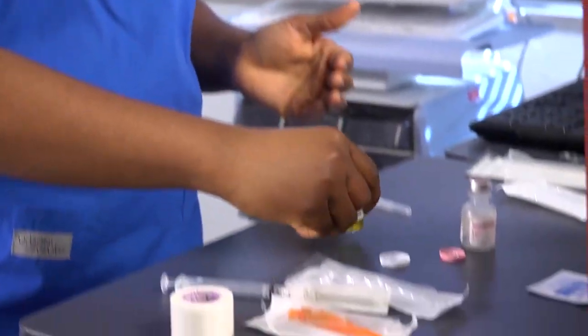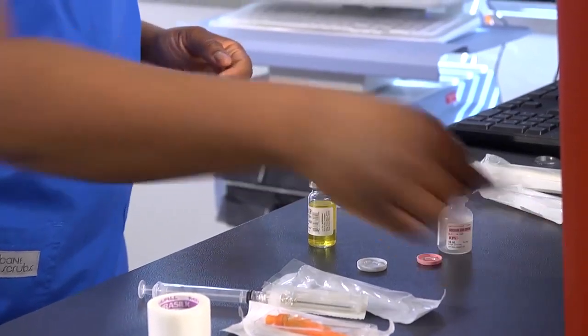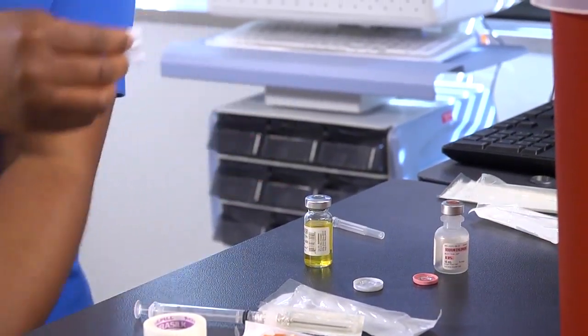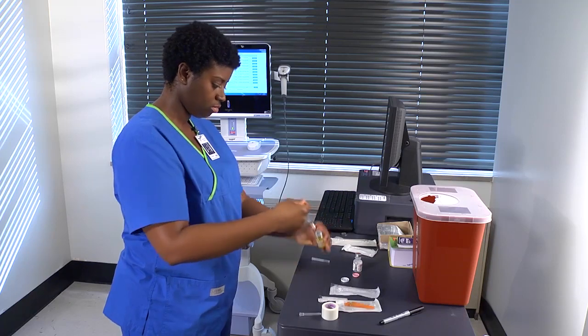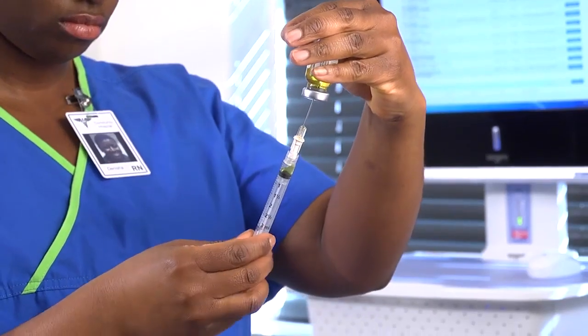After you reconstitute the medication, read the label carefully to determine the concentration of the drug. Draw up the appropriate volume of medication based on its concentration in the reconstituted formulation.